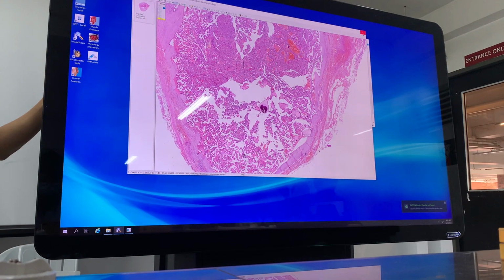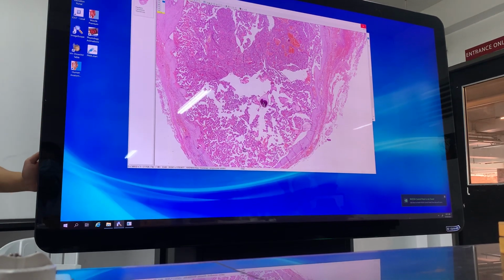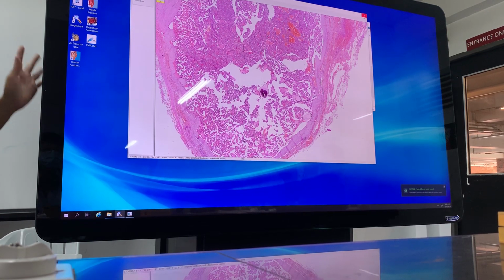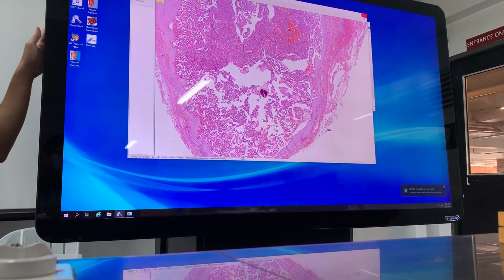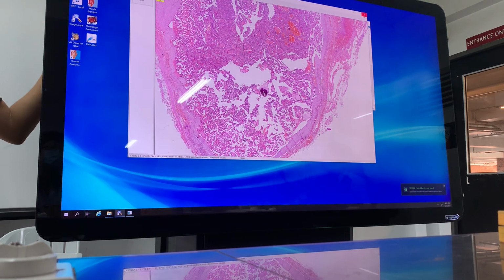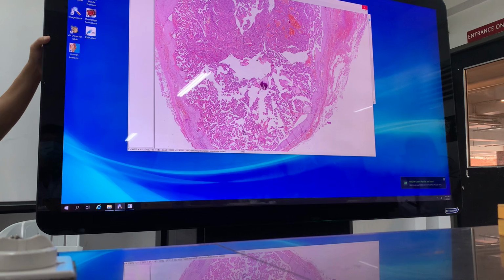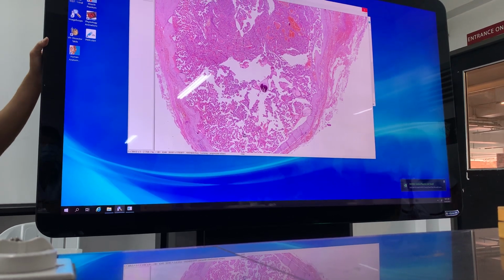I like using this. This is a center. In this, it actually has a body where you can see the organs. Do you use this in anatomy? Have you used this in anatomy yet? But this also has histology too, and pathology.